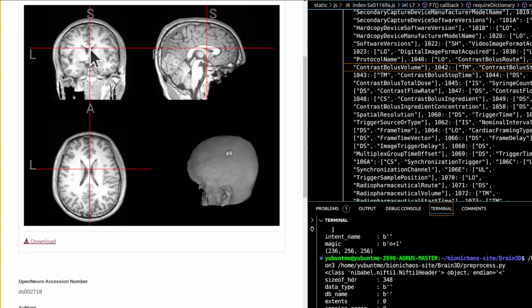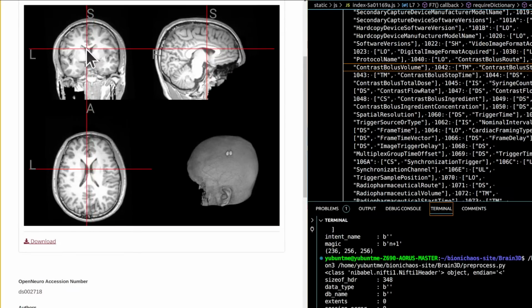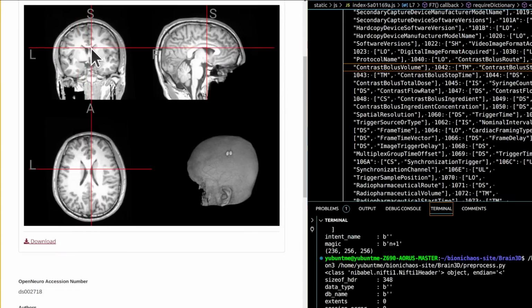Example workflow of how openneuro.org might work. 1. File request. The user requests a .nii.gz file from the server. The file begins to download, and if streaming is supported, the data is processed as it arrives. 2. Data decompression. The compressed .nii.gz file is decompressed in the browser using JavaScript or WebAssembly.